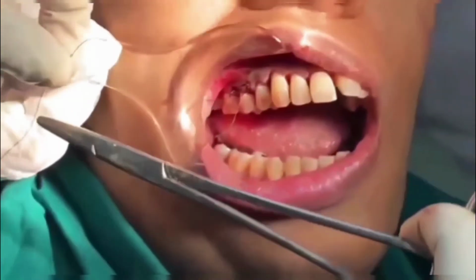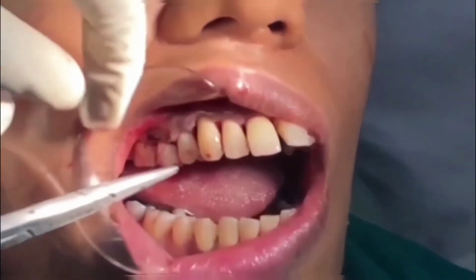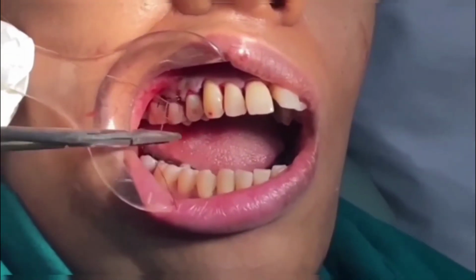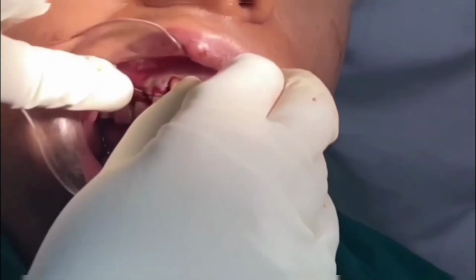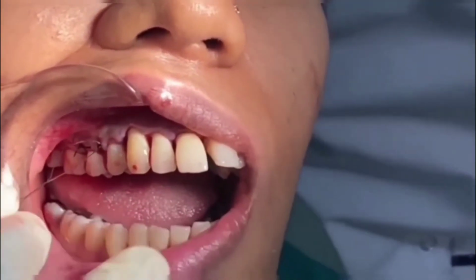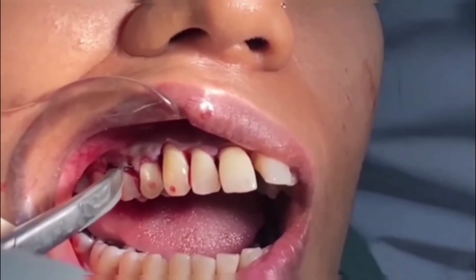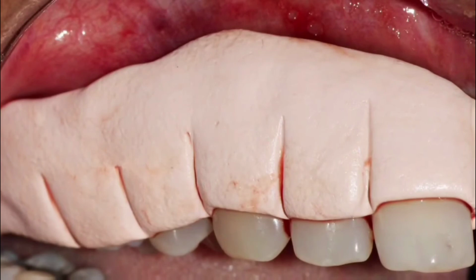And then the knot was tied on the buccal side of the flap. At last, periodontal dressing was placed on both buccal and palatal aspects of the flap.